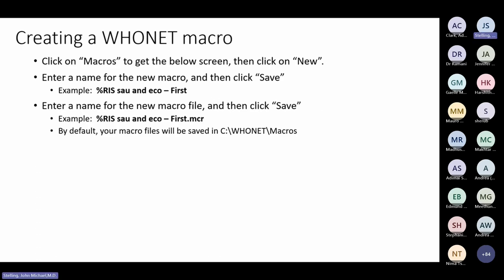Now that I've run an analysis, how do I create a macro? Click on Macros at the bottom of the screen, then click New Macro. Enter a name — for example, '%RIS, Staph aureus and E. coli, first isolate with antibiotic results'. Click Save once to save the macro name, then click Save again to save the macro file. Hoonet will suggest a filename like '%RIS_Staph_aureus_E.coli_first_only.MCR'. By default, your macros go into the Hoonet macros folder.